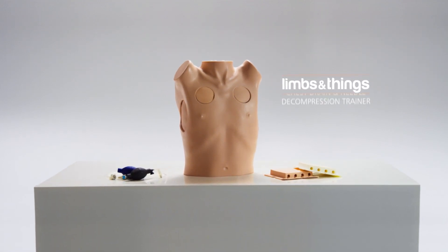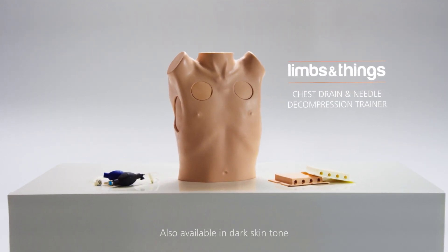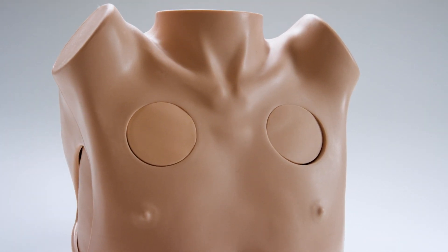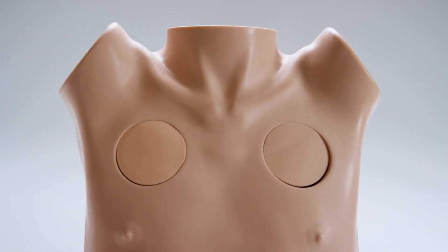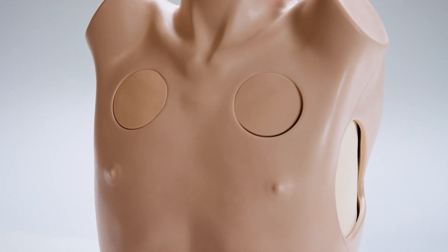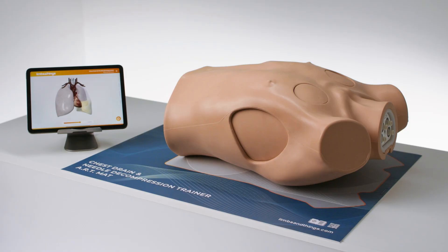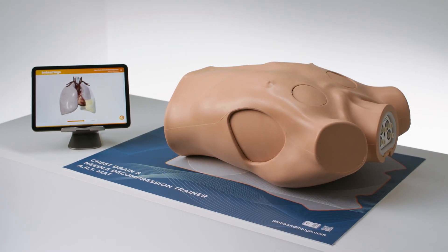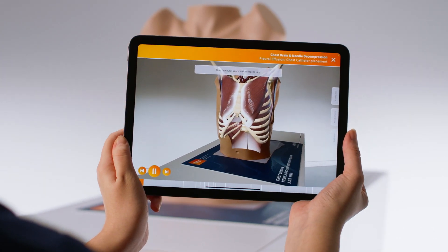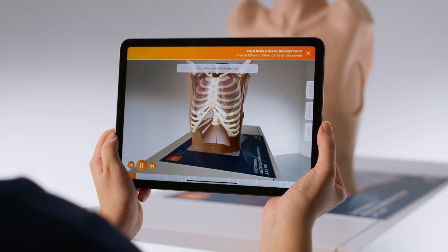This is the chest drain and needle decompression trainer from Limbs and Things. It is an anatomically accurate representation of an adult male torso, providing a complete training tool for chest tube insertion, chest drain and needle decompression. The trainer is integrated with augmented reality training, Limbs ART, overlaying the internal anatomy of the thoracic cavity.